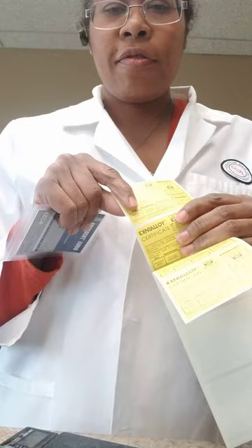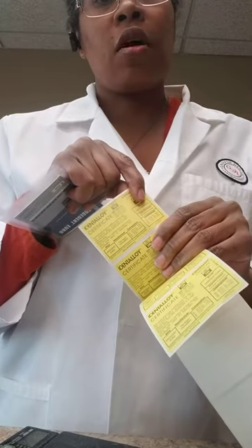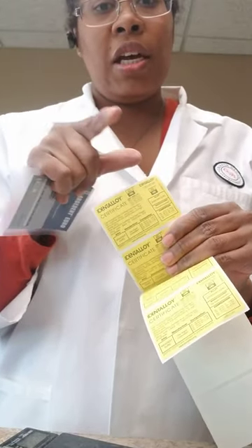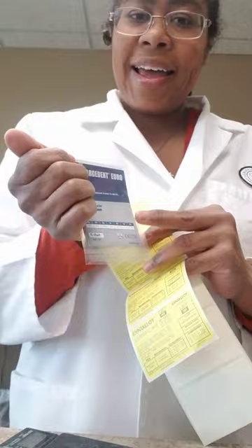I'll put this half in with the dentist and this half will go on our lab slips. That way I know what I used on each case, and the doctor also knows what was used on each case. So that's pretty much it — that's all I've got.